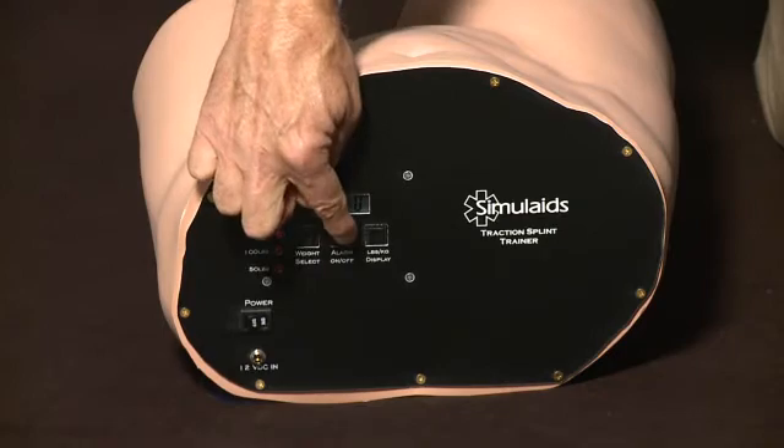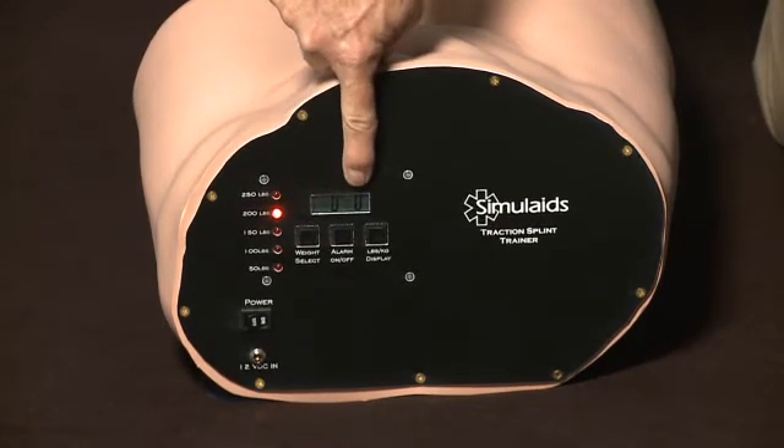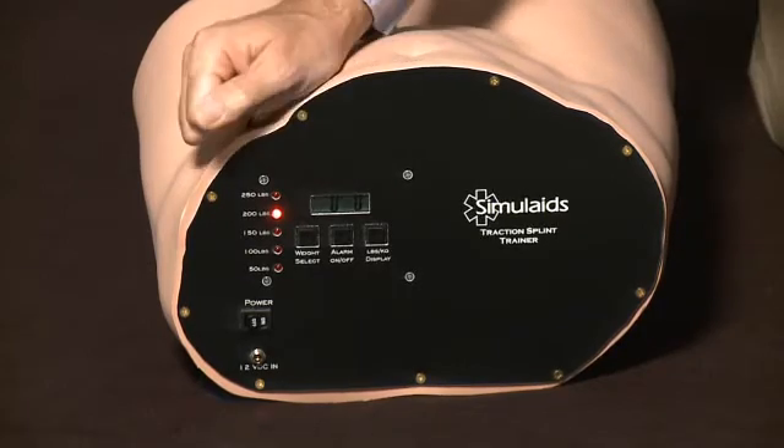You may turn that audible system off, and the digital readout tells the instructor what the pressure is during testing.